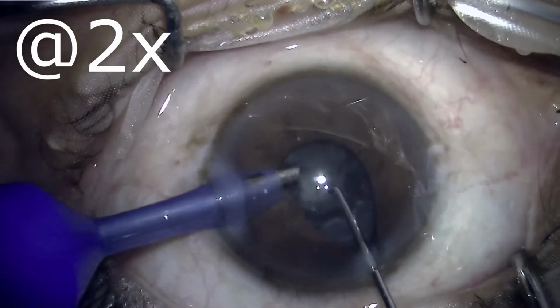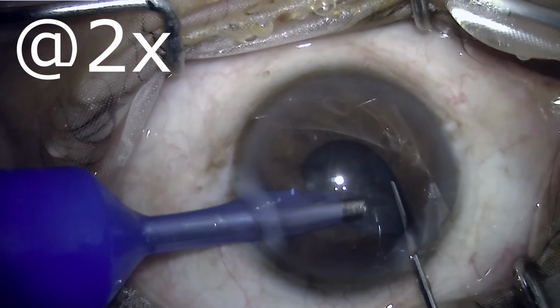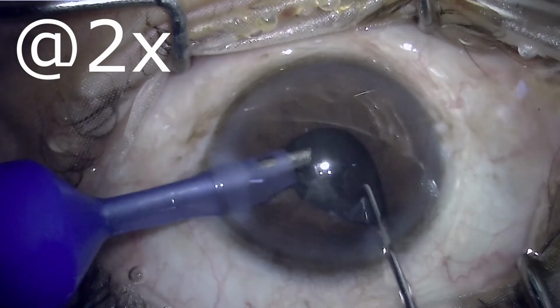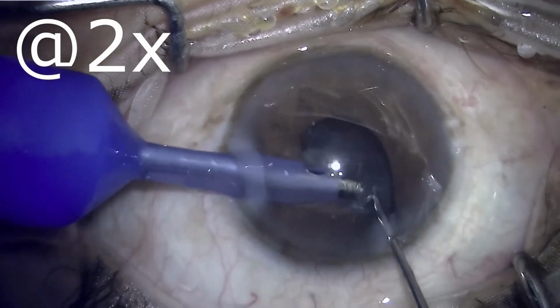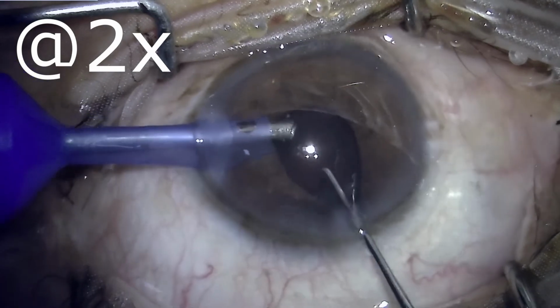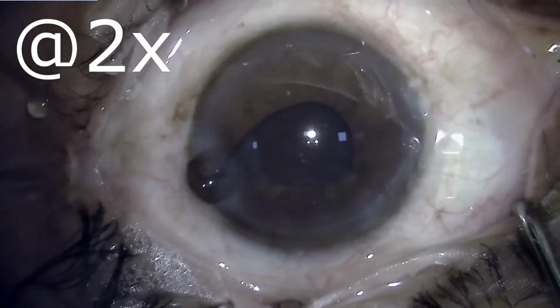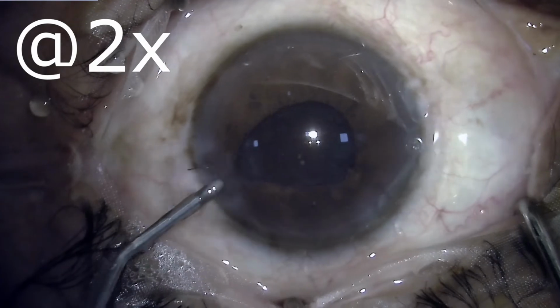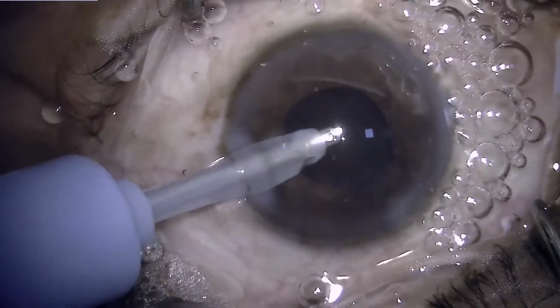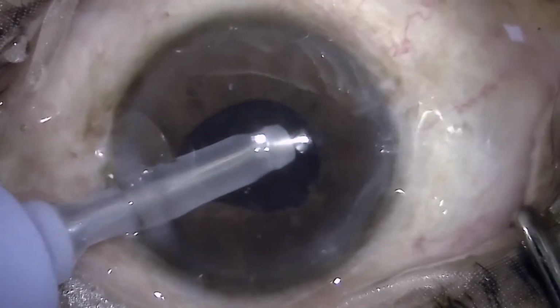So this way we have been able to remove most of the nucleus material, removing some amount of epinucleus which is remaining there, and we can appreciate the size of the pupil has gone down reasonably. Interestingly, the other eye was operated recently and it had a corneal opacity in the periphery, and it has recovered fully with 6/6 vision. And in a situation like this, when the iris prolapse occurs, instead of pushing the iris back, the first thing required is to release the intraocular pressure. So just let the anterior chamber have a burp, and then the iris will go back by itself.